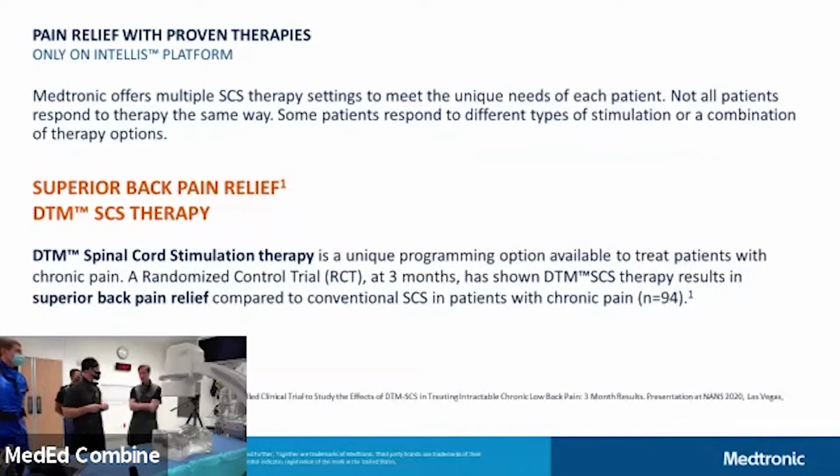So one of the things that I do that's maybe unusual is I do competitive trials. So I put a lead in and I try 3 different systems out. I would try them all out if I could, just based on timing and risk of infection, et cetera. You can only keep the leads in for so long. But I do competitive trials, and this system has changed the landscape a little bit. So patients, I'm not vendor specific. You know, I'm agnostic.